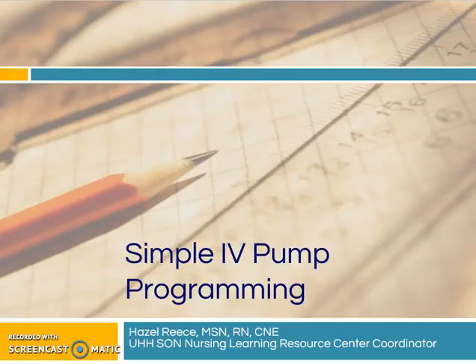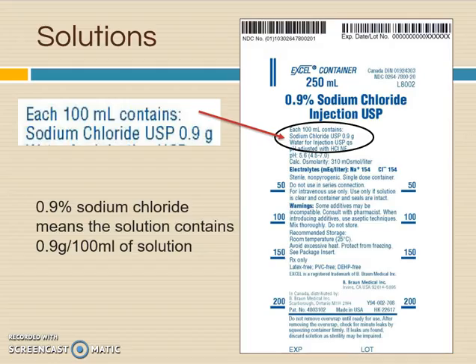Here's another set of problems having to do with programming a pump, an IV pump. So first of all, I want to show you that this is normal saline. They call it normal because it has the same amount of sodium chloride as blood does.